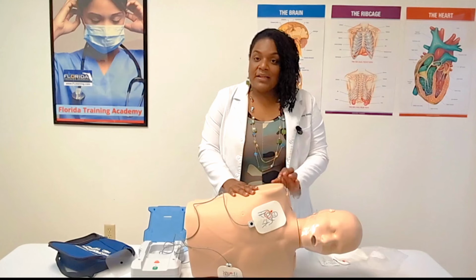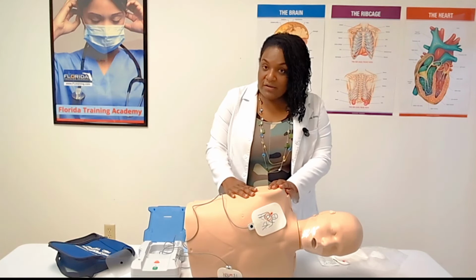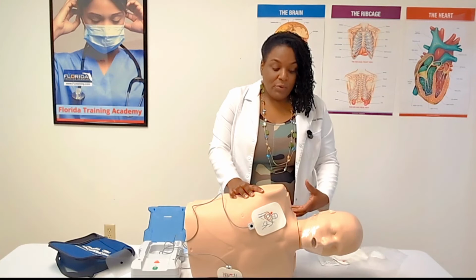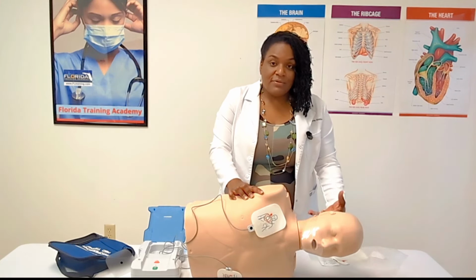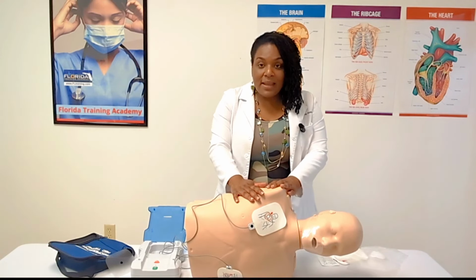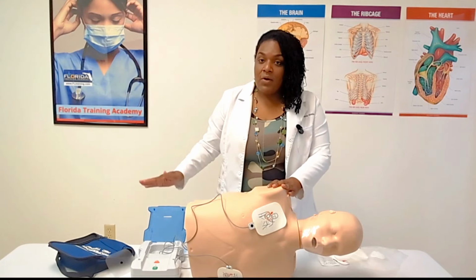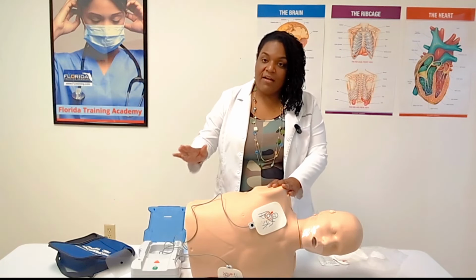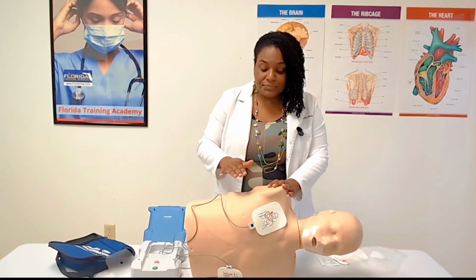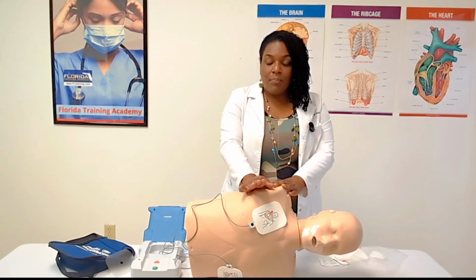And if you're in an area that doesn't have a hospital bed or a bed that can elevate, you're going to turn them to their side, because more than likely they might vomit. And if they vomit, we want to make sure that the vomit is able to clear their airway. Keep the device on until the paramedics arrive or until someone with more experience takes over. This is going to keep monitoring your patient, and for every 2 minutes, it's going to determine whether or not another shock is needed. We turn them to the side, which is the recovery position, because they regained a pulse.